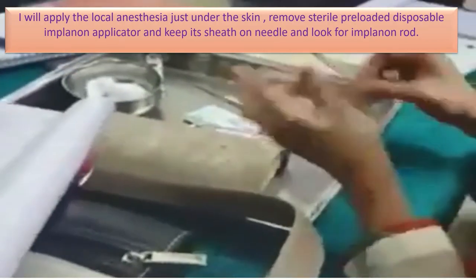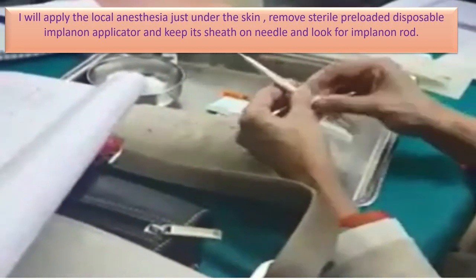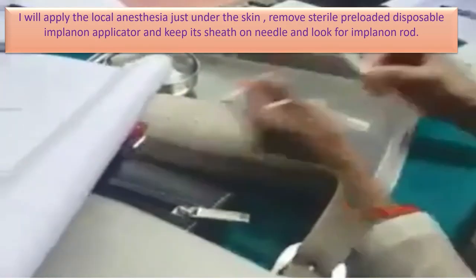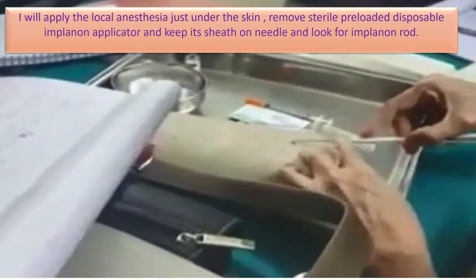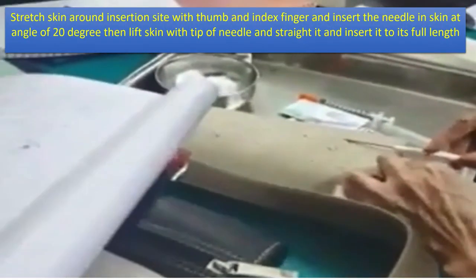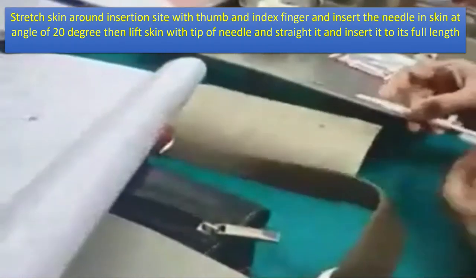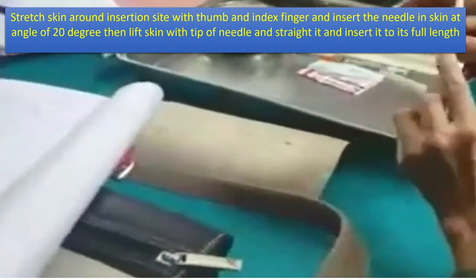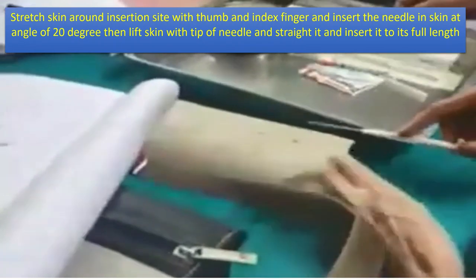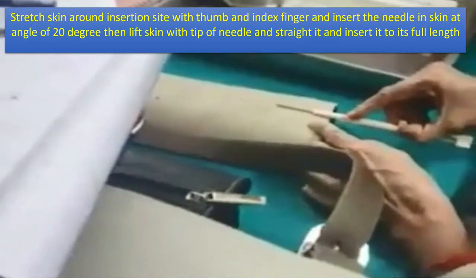Apply local anesthesia under the skin, remove the sterile pre-loaded disposable Implanon applicator, and keep its sheath on the needle. Stretch the skin around the insertion site with the thumb and index finger, insert the needle into the skin at an angle of 20 degrees, then lift the skin with the tip of the needle, straighten it, and insert it to its full length.